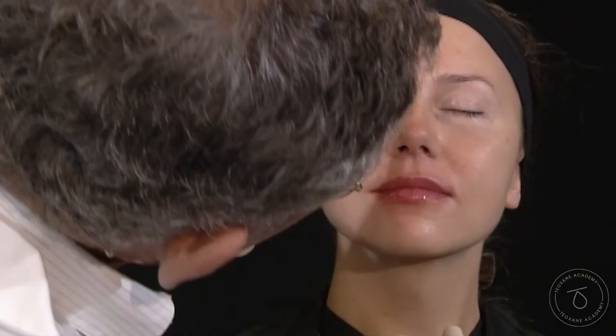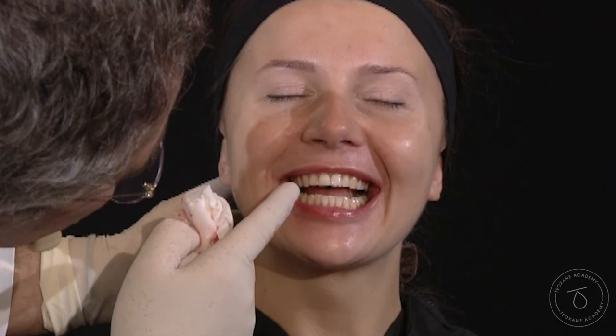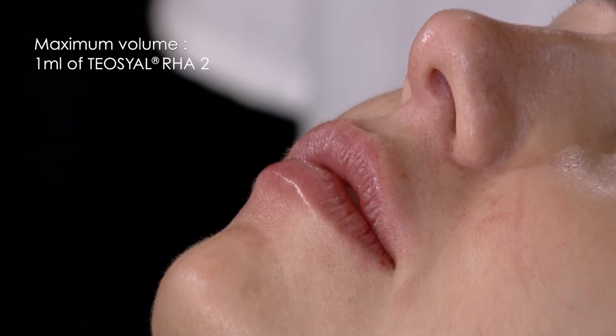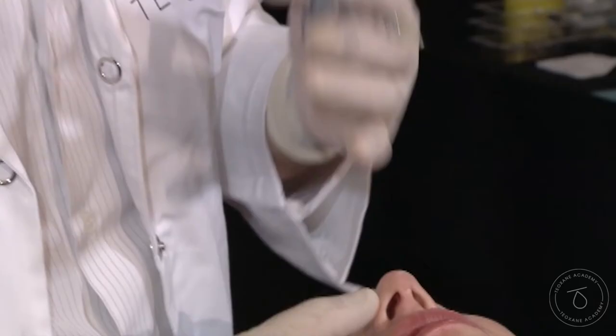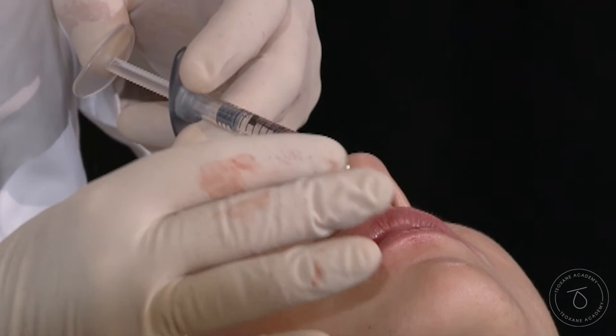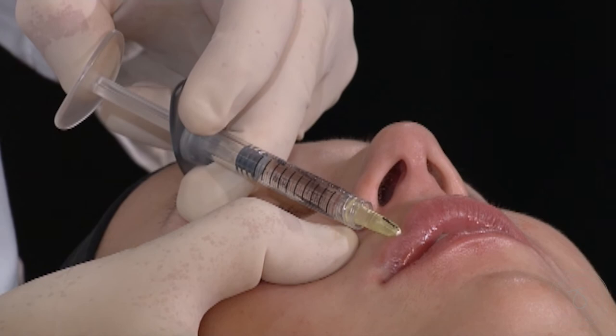Then you check — you smile. You see? That's a tragedy. I analyze the dynamic of the smile — it's essential. You see the gum now, it's not right. Normally I rarely use more than one milliliter. It's exceptional. Now I can do that — look at this. I reverse the lip with my thumb, I go tangent, I know exactly where my filler is coming out, and I inject inside the red. Introduction — can you see it? And I go boom, the four millimeters in. Now you can see the filler going into the red part. And I can mold and sculpt it.